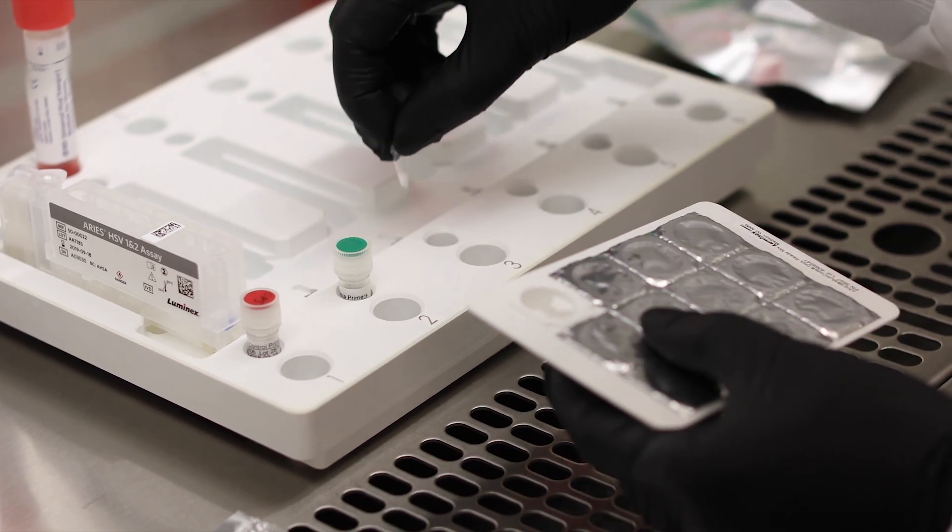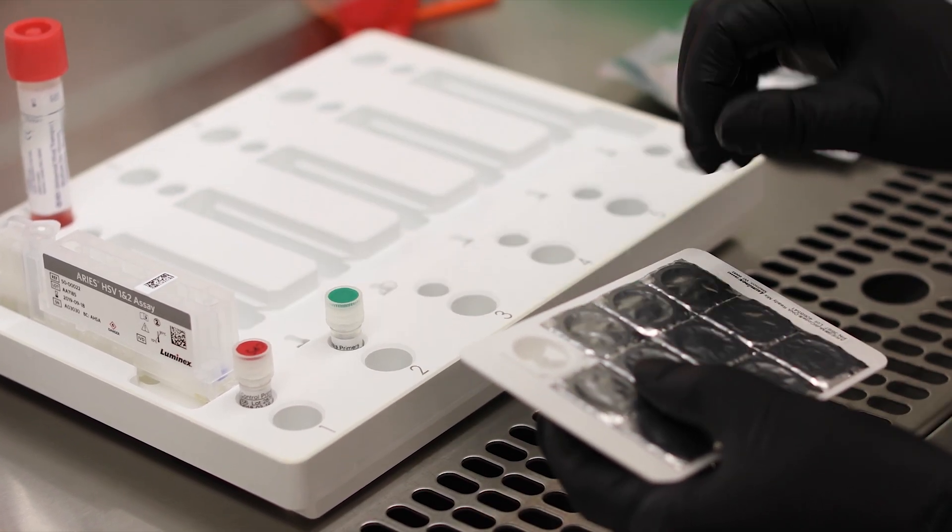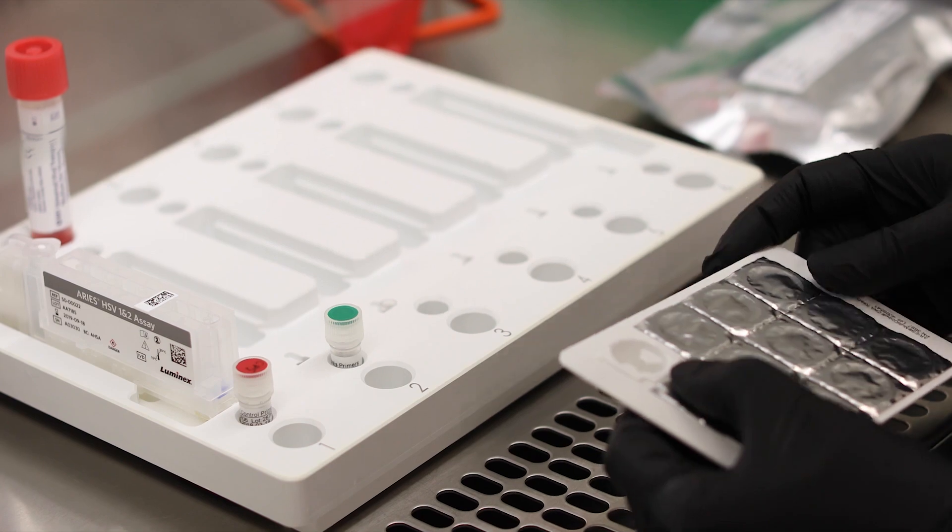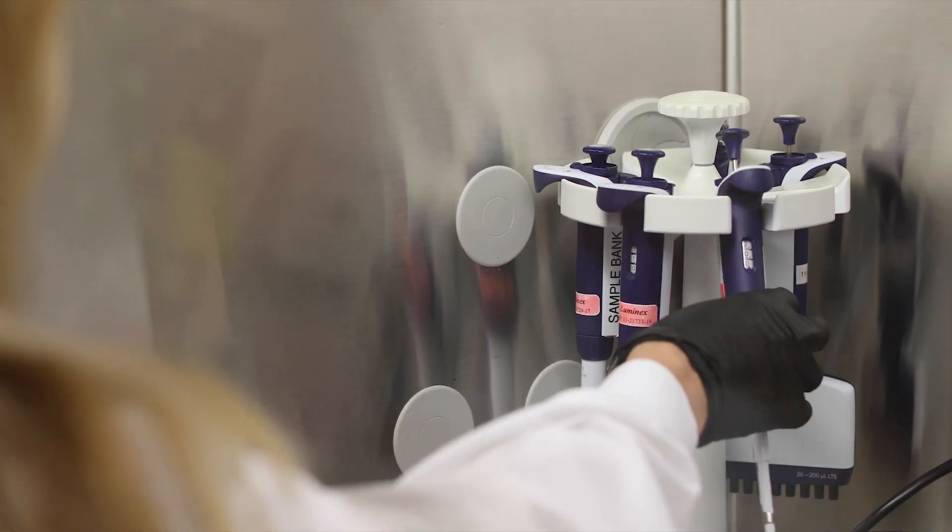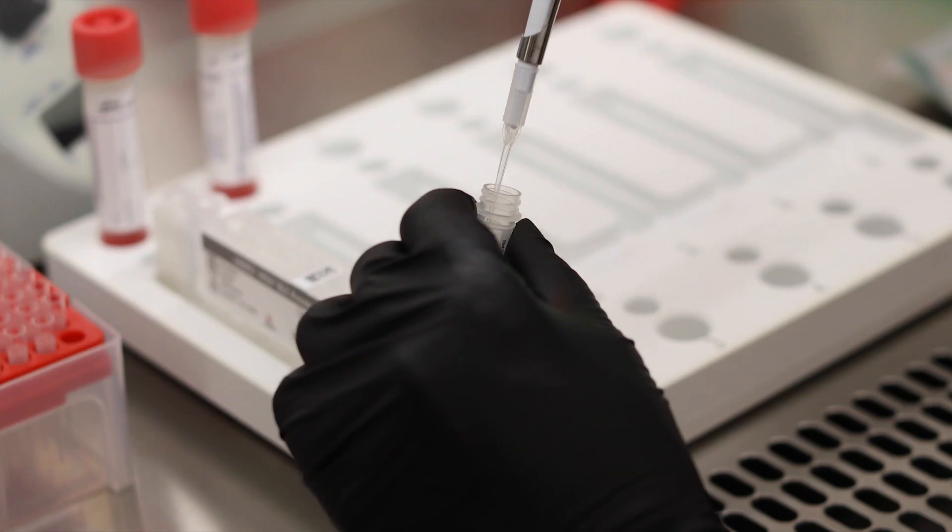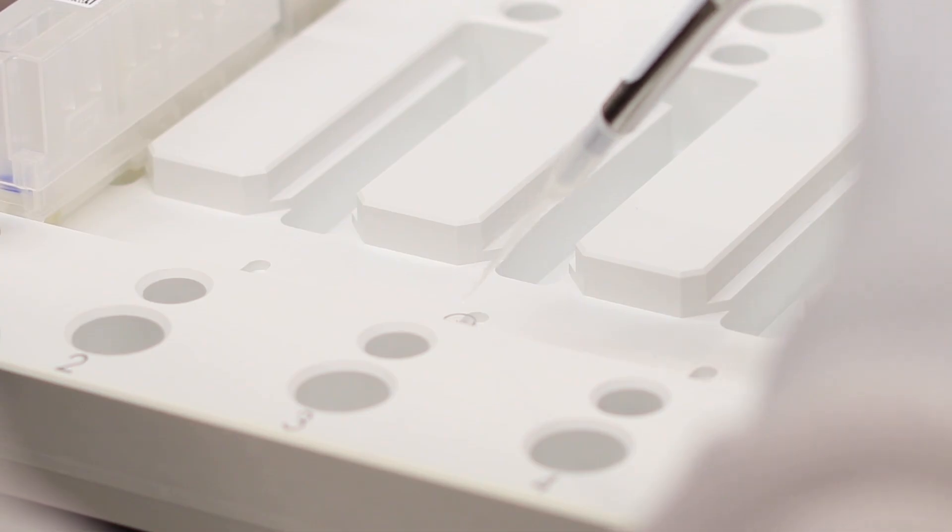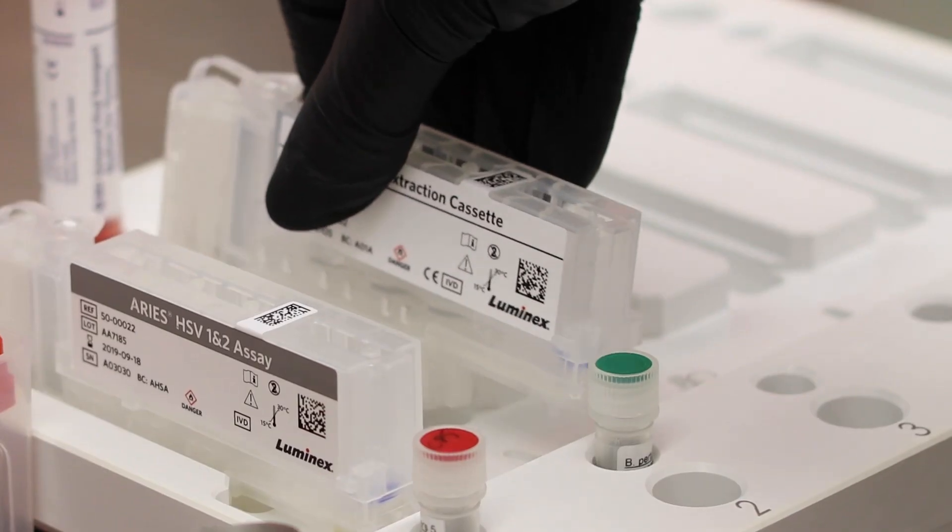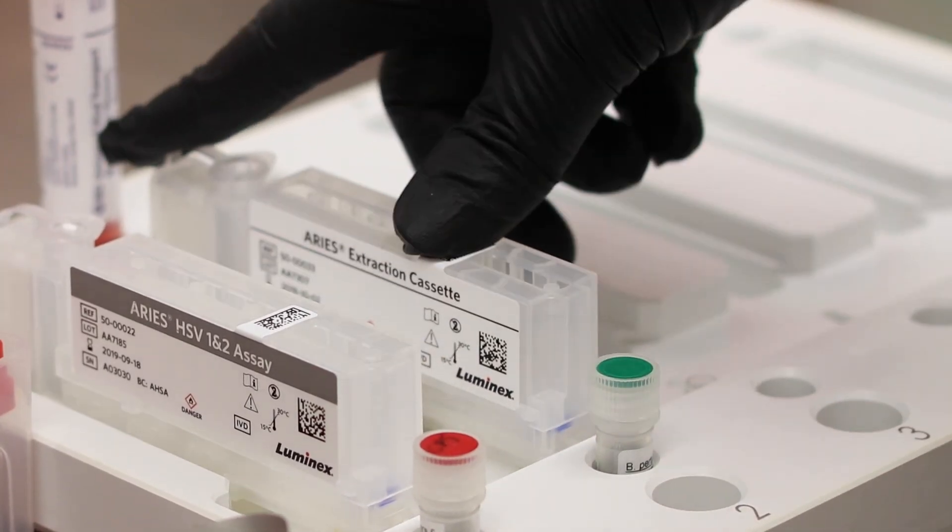To begin the assay workflow, place your ready mix tubes into the sample prep tray. Then add your primers or primers and probes to the ready mix tube and attach the tube to the Ares extraction cassette.